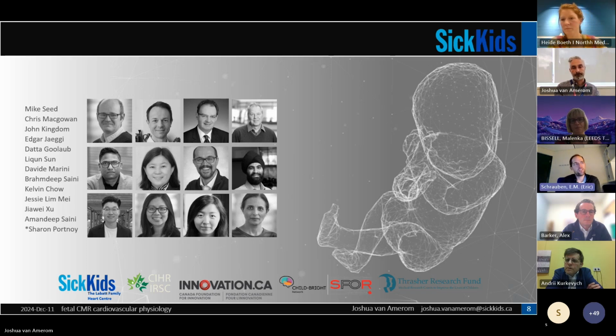Yeah, and I would just add, I think that we won't be abandoning 2D flow anytime soon, but as Josh suggests, it could be possible to have multiple images or slice locations acquired within one stack. I think the group in Denver is already doing this, where they have a prescription and then acquire just the next slice up from there, hoping that between one of those two, something will be usable, because you do expect some motion to happen.